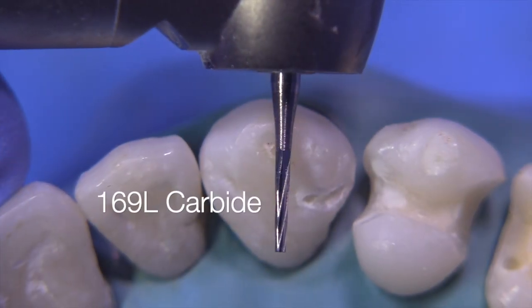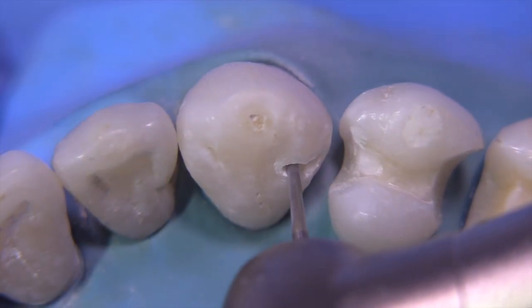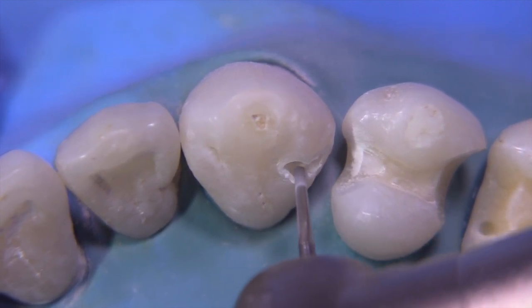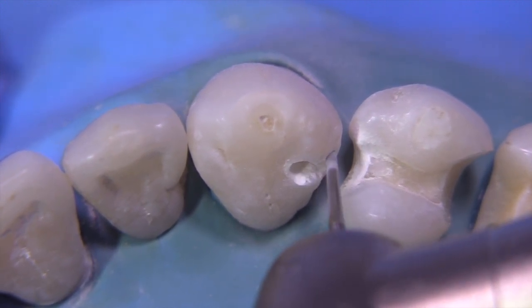Now we're going to use the 169L carbide. You could also use maybe a 55 burr and tip the burr. But you can use the 169L, keeping it perpendicular to the lingual surface and tipping the burr a little bit to get the proper divergence to this inlay portion.